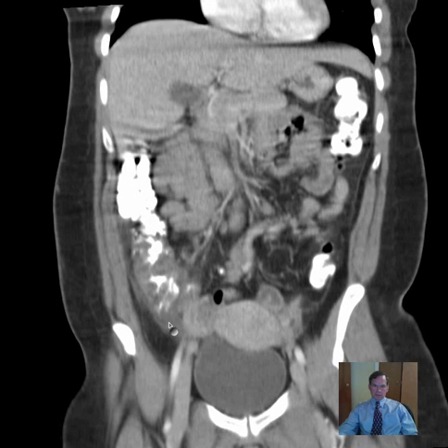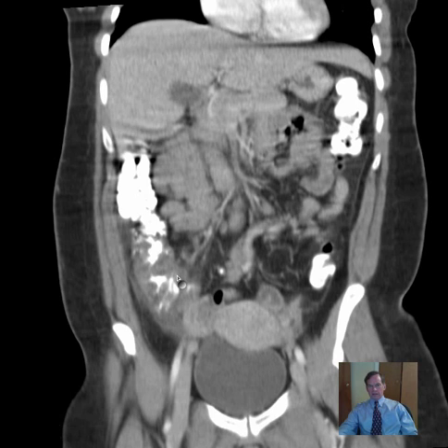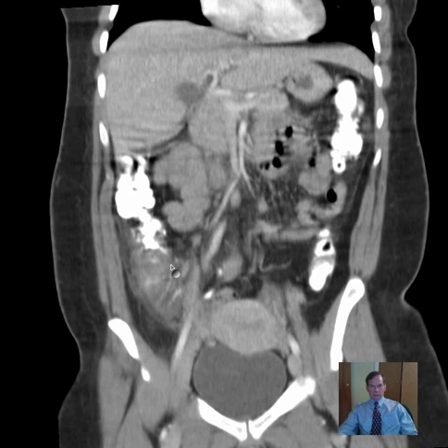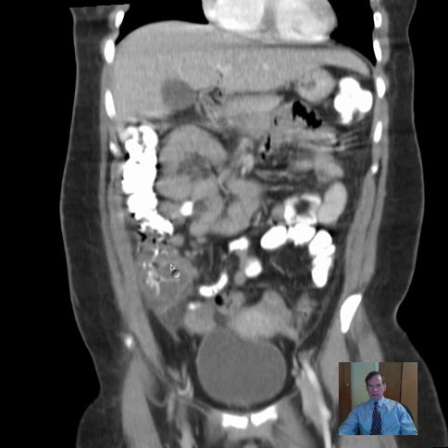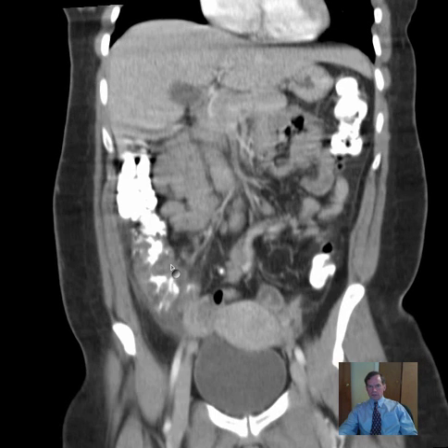So we have these pronounced inflammatory changes in the right colon. I would say an infectious enteritis is a foremost consideration in this case. Ulcerative colitis also is a possibility.